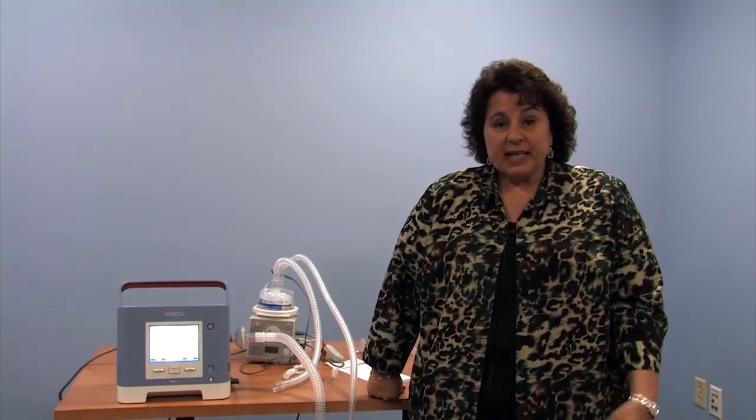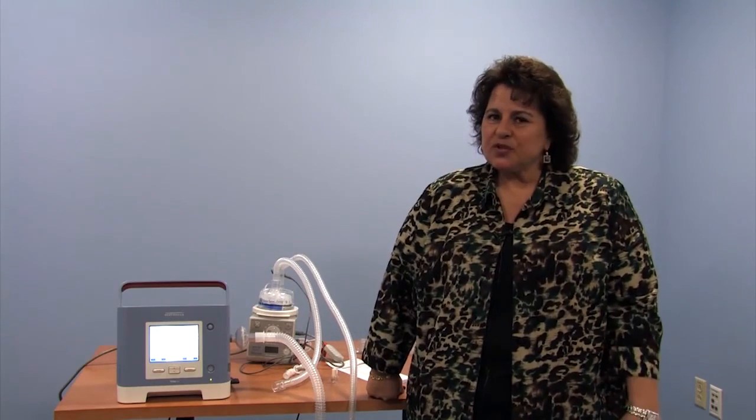When it comes to a tracheostomy tube, we do provide heat and humidity for our children because their tracheostomy tubes are smaller than the adult tubes typically, and we don't want any risk of plugging. We'd like to keep the secretions thin.